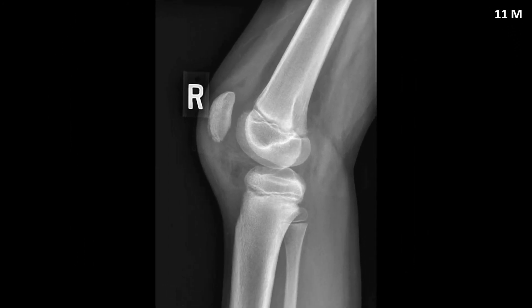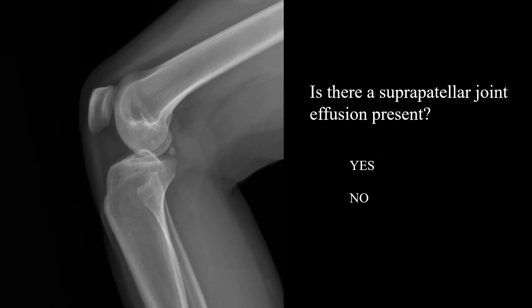Another helpful sign of a joint effusion is anterior displacement of the patella, which is only seen in very large joint effusions like this one. Now let's try a couple of examples — is there a suprapatellar joint effusion present?